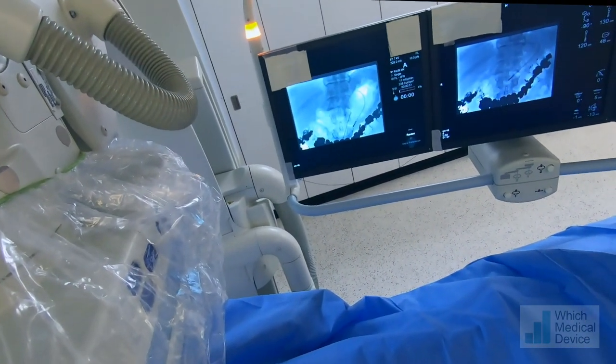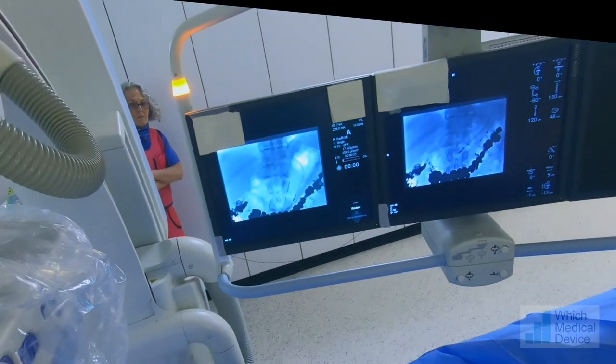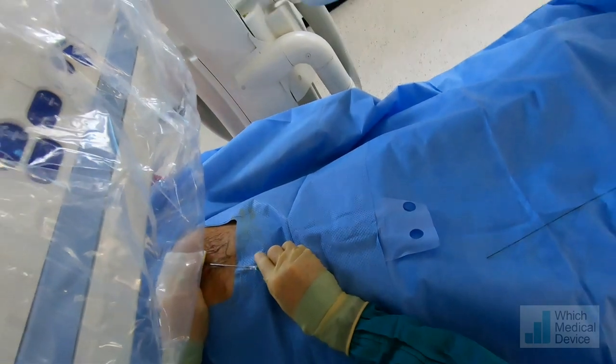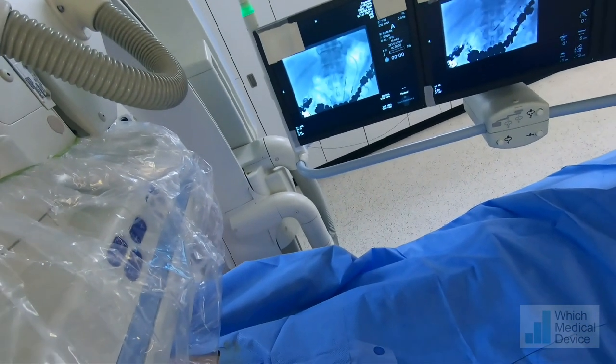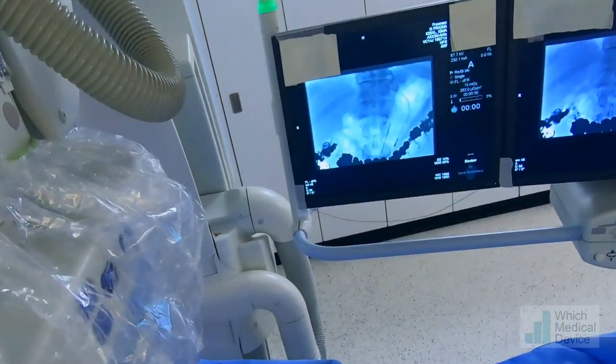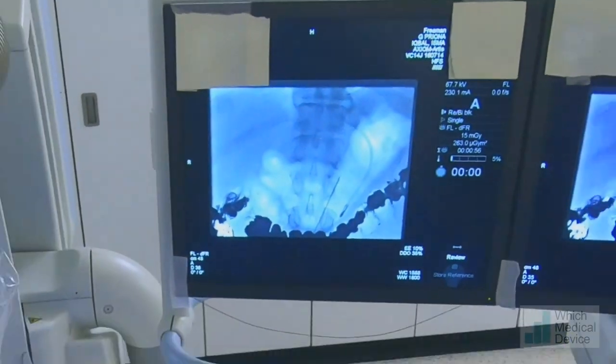I'm just checking our position. The stomach has actually changed position a bit, so we're going to put some more air in now. We might need to reposition and put more local in — we always check throughout the procedure that the stomach hasn't moved.